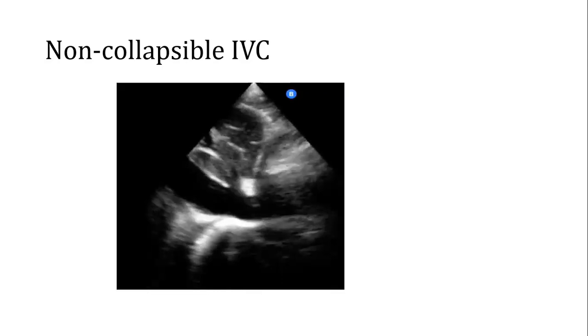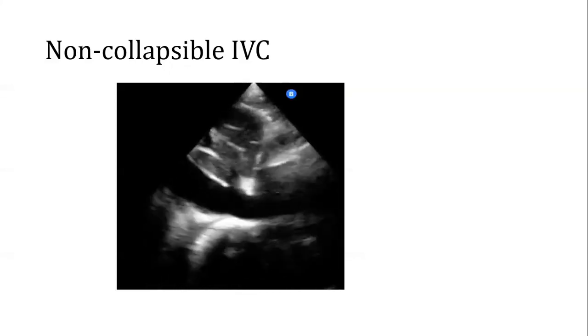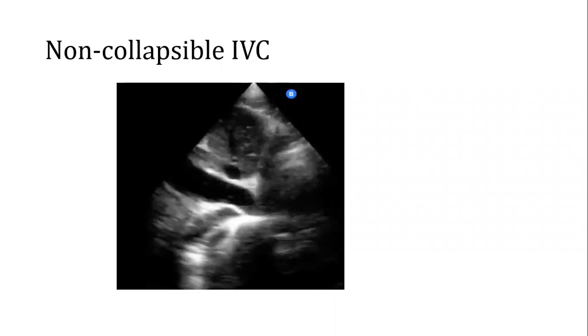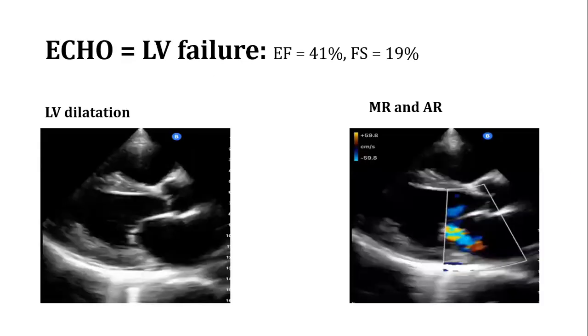in the right cardiac or heart chambers. Depending on your expertise, as in imaging, all those who have done echo mostly use the IVC, but some people will use the jugular vein, and you'll find the same findings. There's no collapsibility. So once we found there's no collapsibility of the IVC, it means there's something not right in the right heart chambers. And we ended up doing an echo.